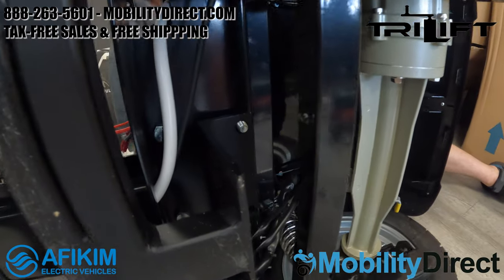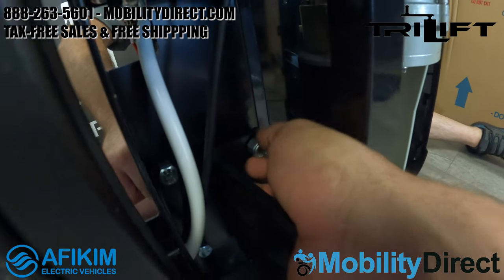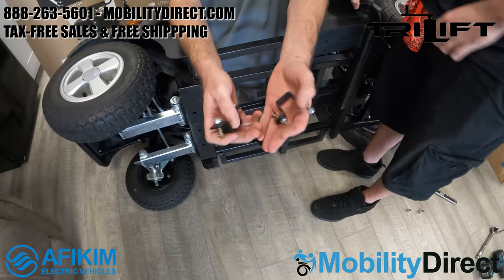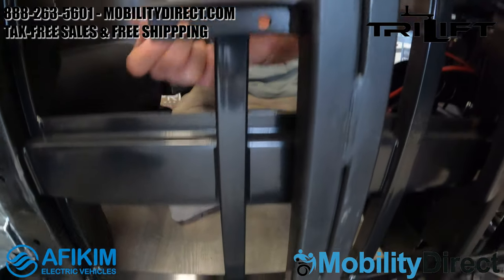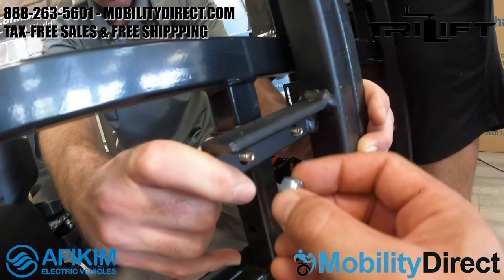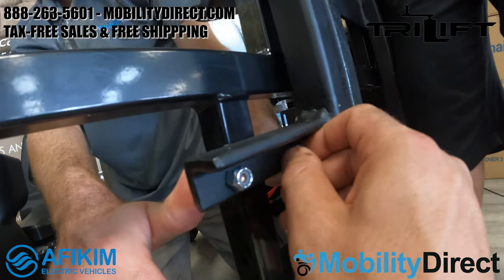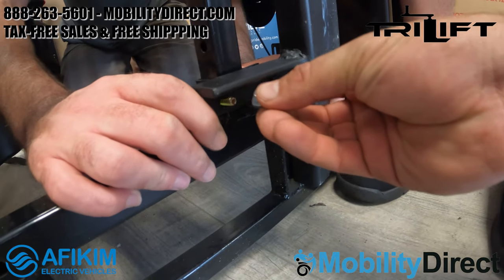Just install one of the bolts first and get that nut on there finger tight. You actually need about three sets of hands to get this job done right — one person holding the bracket, one person on the back side pushing the bolt through, and another helping with the nuts. Pay close attention to the orientation of the bracket. You will need to get this matched up exactly how it's shown in the video and in the diagram that comes with your tri-lift.